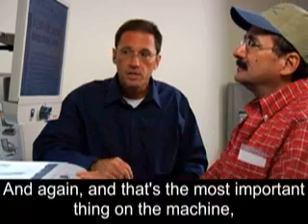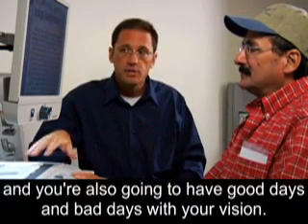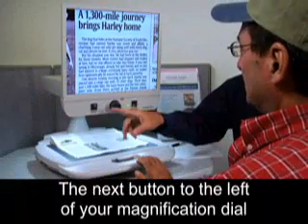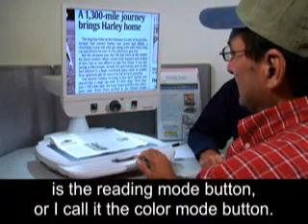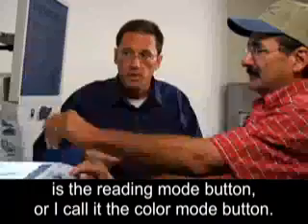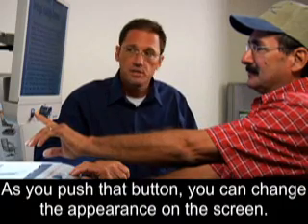That's the most important thing on the machine because you're going to run into all different sizes of print, and you're also going to have good days and bad days with your vision. The next button to the left of your magnification dial is the reading mode button, or the color mode button. As you push that button, you can change the appearance on the screen.